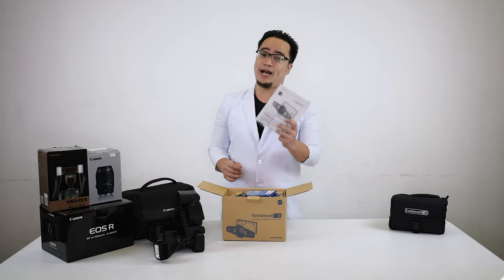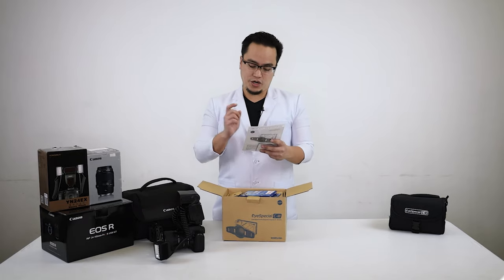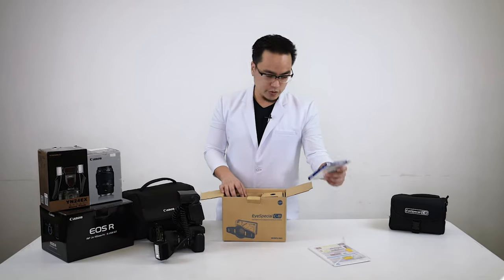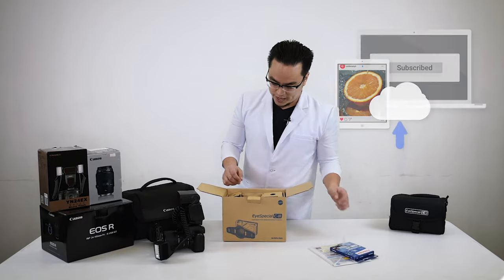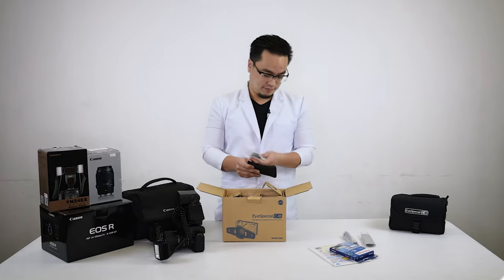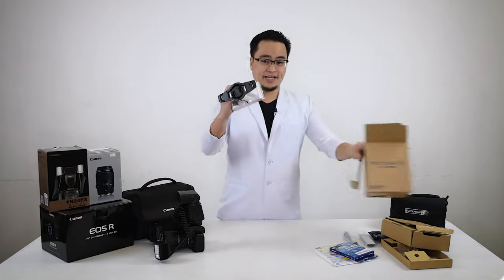It has its own manual, which you should actually go through because all of the functions are built in and you're going to need to learn those really well. There's a memory card with Wi-Fi transfer, which means it automatically uploads to your iPad or laptop if you have one set up nearby. Cords, a nifty little macro lens, and the camera itself.